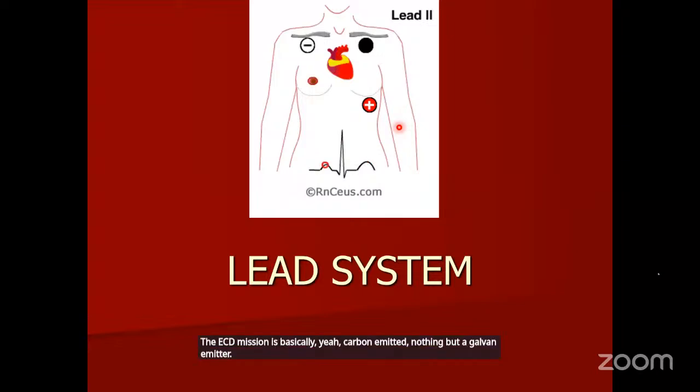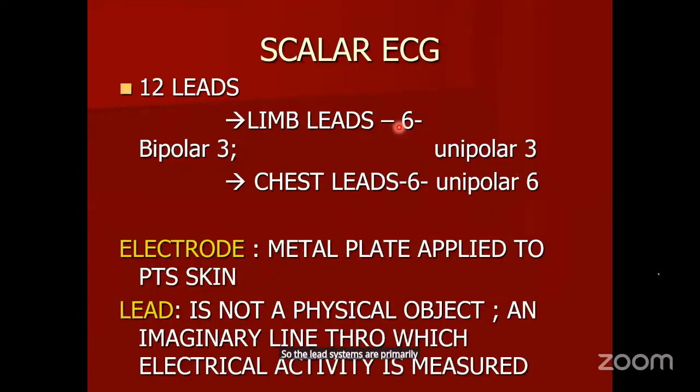The lead systems are primarily designed to see the various surfaces of the heart. I told you the purpose of electrocardiogram is to see all my cardiac myocytes, wherever they are. They are depolarizing normally and repolarizing normally. So that means I have to have a system by which I can see all the surfaces of the heart. So the lead system helps me to see all the surfaces of the heart.